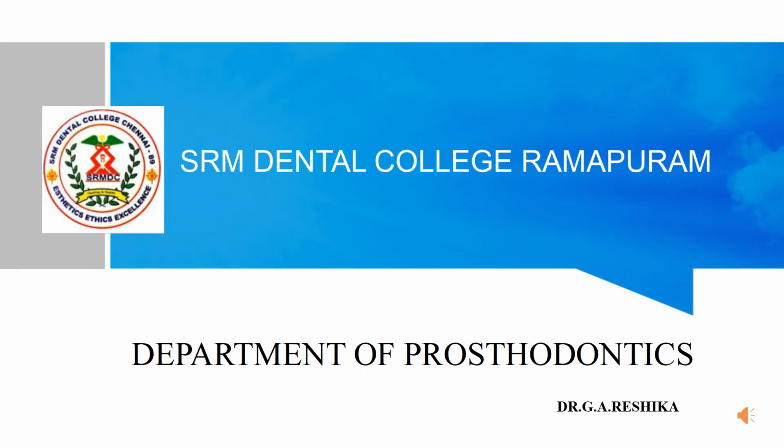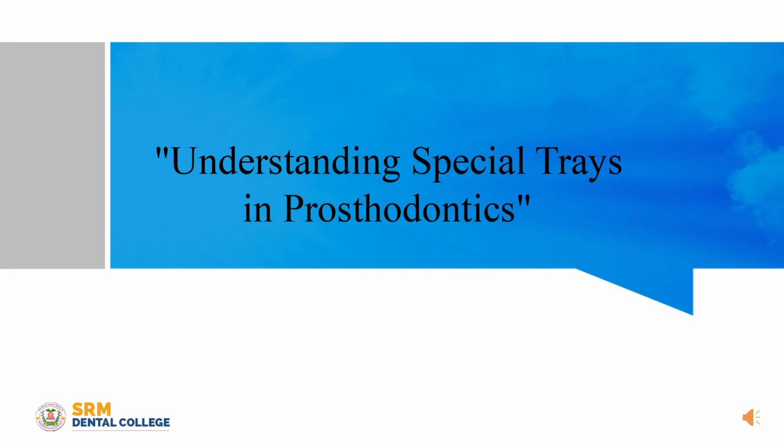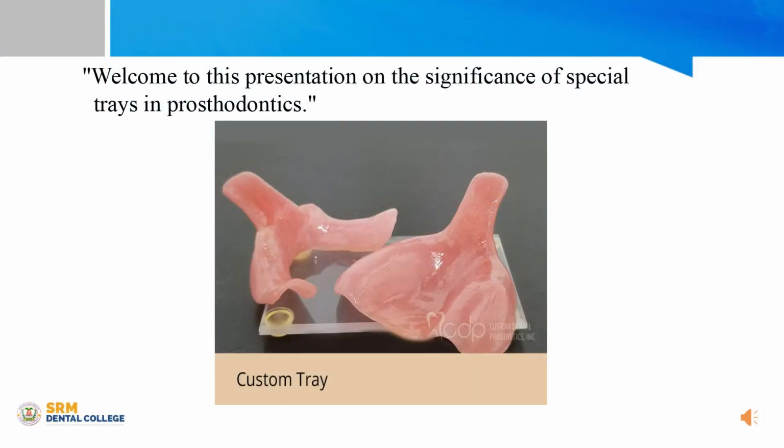Hi all, today's topic of discussion is understanding special trays in prosthodontics. Welcome to this presentation on the significance of special tray in prosthodontics. Special tray is otherwise called as custom tray.